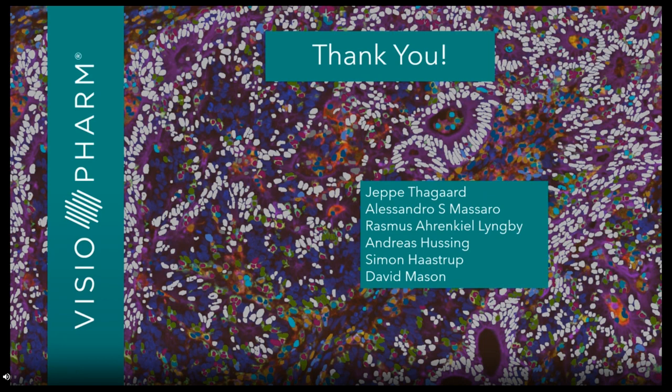So you have some tools at hand that you can use. For example, you can use one of our normalization tools that we recently deployed, where you can do the normalization across images in your batch. And we are still working on how to do a good image normalization, thresholding, and have this adaptively transferred onto other images.